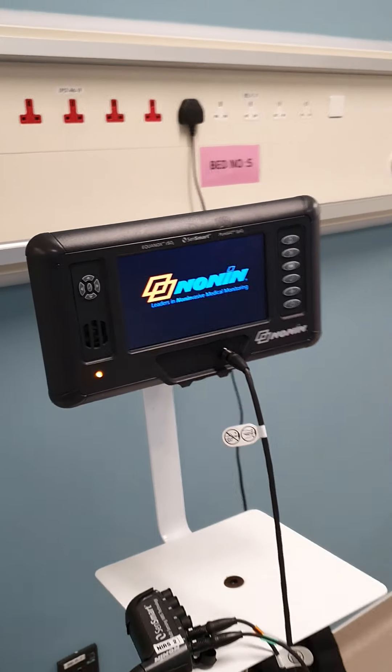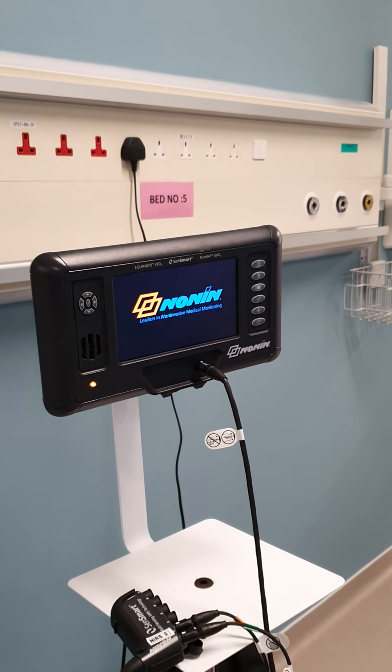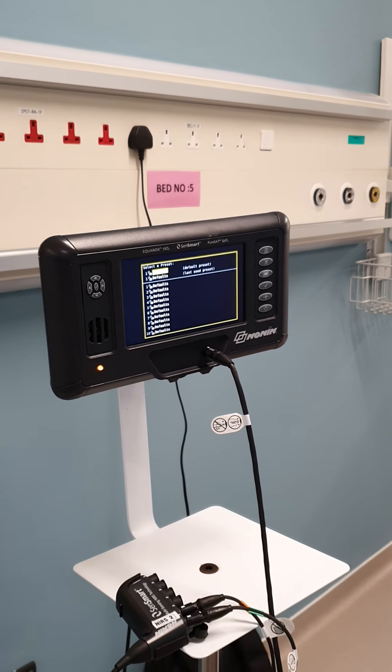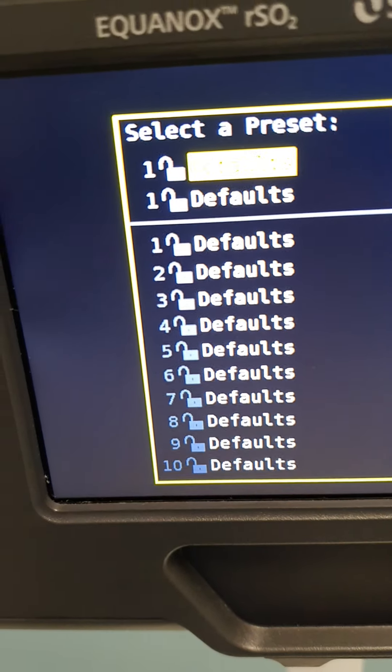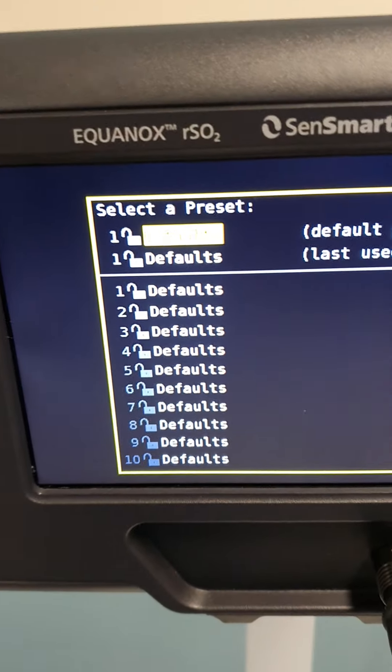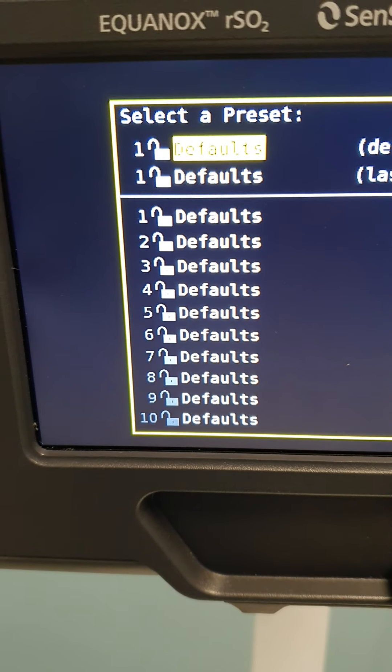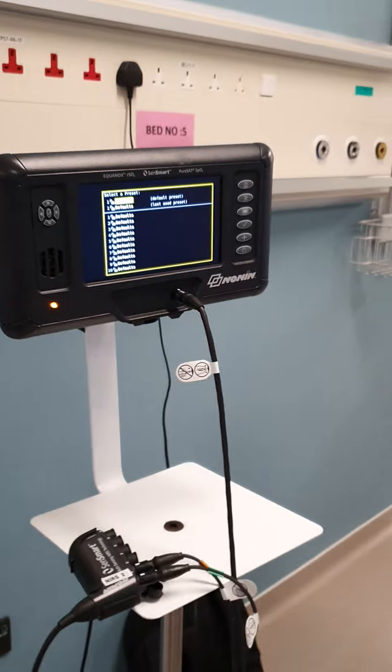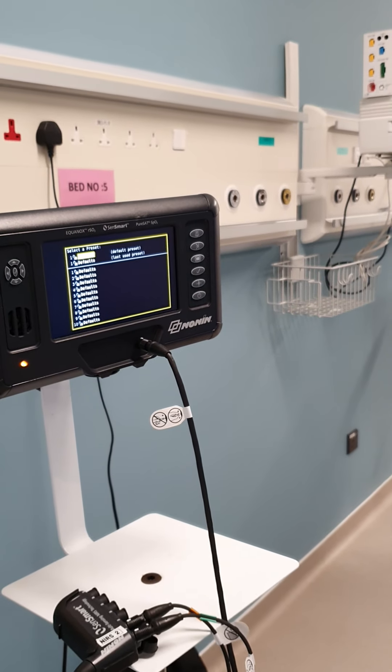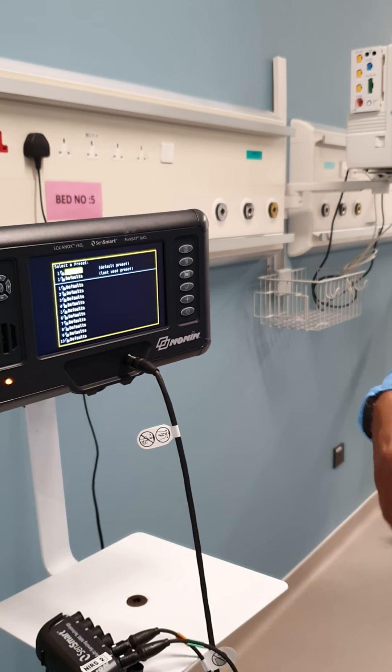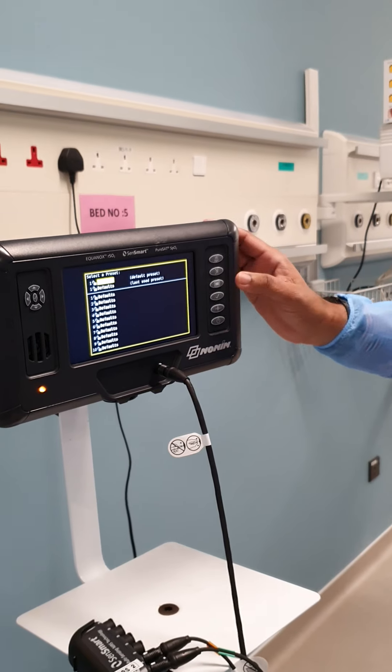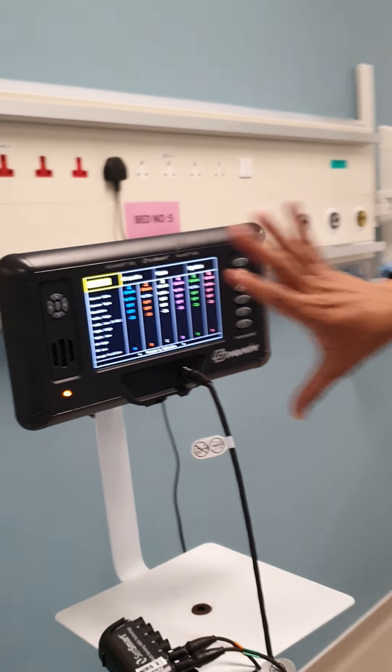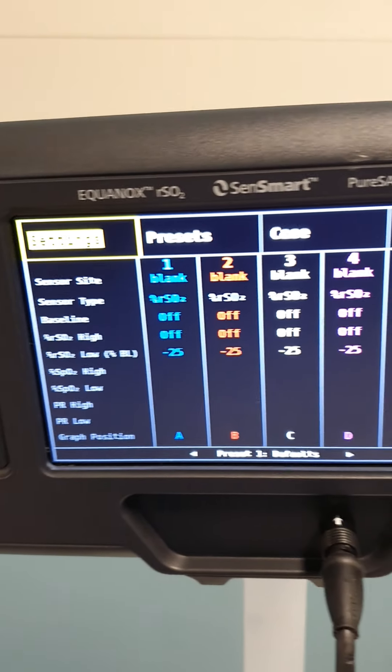Once the machine is switched on, it will do its own self-test. Here you can see something called presets. These presets are useful in hospitals depending on the different doctors who are using it. Every doctor has his own work style. Depending on work style, we can set it. Some doctors want alarm, some don't want alarm. Some want baseline, some don't want baseline. Depending on the doctor's usage, we can have twelve presets.